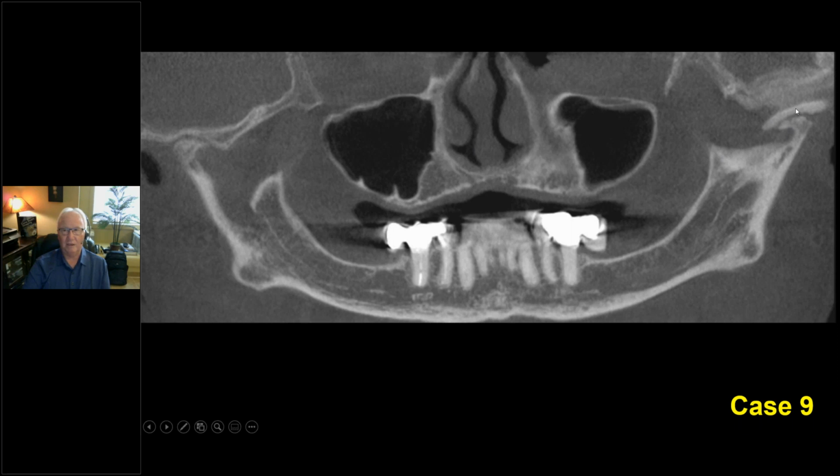Even the articular eminence is involved on this one. So they've got bilateral osteoarthritic changes, and that might flare up when you put them back in function. And then they're going to blame you for their joint pain. So it's a lot easier to start with imaging, say, Mrs.